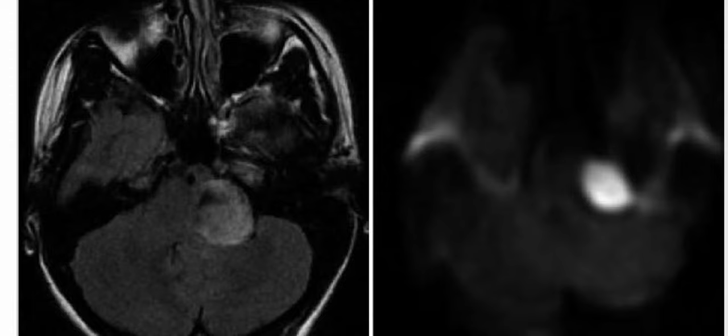The post-contrast sequence showed no enhancement, which is not shown here. So this is an extra-axial mass with signal characteristics very similar to the CSF, and it is giving increased signal on DWI. That means that this lesion is giving diffusion restriction. A lesion which is giving diffusion restriction in this typical location of the cerebellopontine angle should always be considered as epidermoid. So this is an epidermoid cyst.